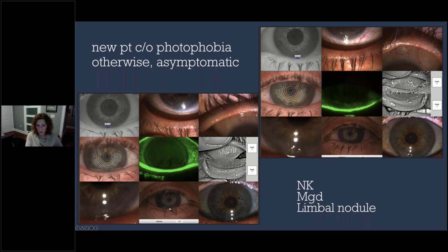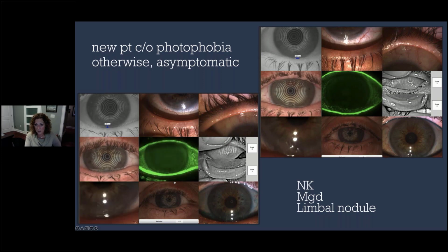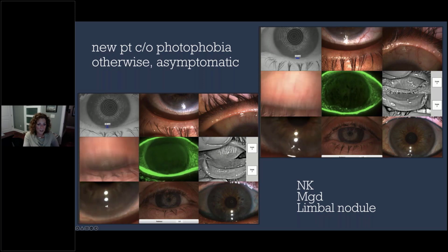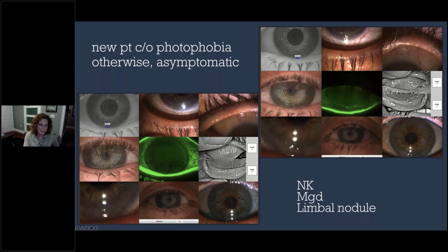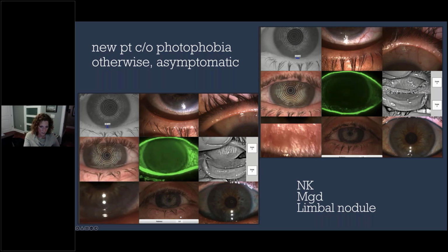What bothers her is her doctor wasn't really set on referring her. Why? Because she was asymptomatic. So I've had to spend 2 visits making up and kind of defending him, saying he just doesn't have the equipment to see it. I'm sorry, he's not a bad doctor. But ultimately, we've got the rosacea. You can see it here on this redness picture. When we back up a little bit, we've got almost total gland loss on the bottom, very few glands on the top, and you can see the degradation on the inferior cornea.